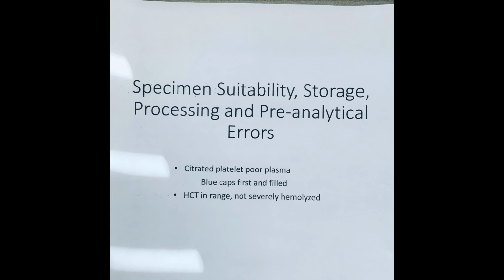taking it into testing. Other labs are more lenient with their coagulation samples, allowing that whole blood blue cap tube to have a shelf life of 24 hours at room temperature prior to spinning and producing plasma that is used in testing. So individual lab SOP is important to check.